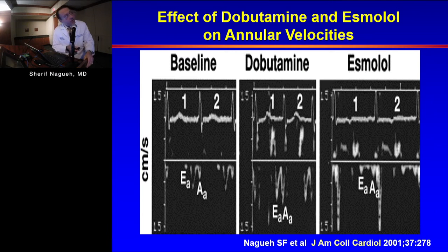How about the effect of LV relaxation? If you enhance relaxation with a drug like dobutamine, notice the faster heart rate, the early diastolic velocity goes up. If you drop relaxation with esmolol, the early diastolic velocity drops down. So now it also is affected by relaxation.